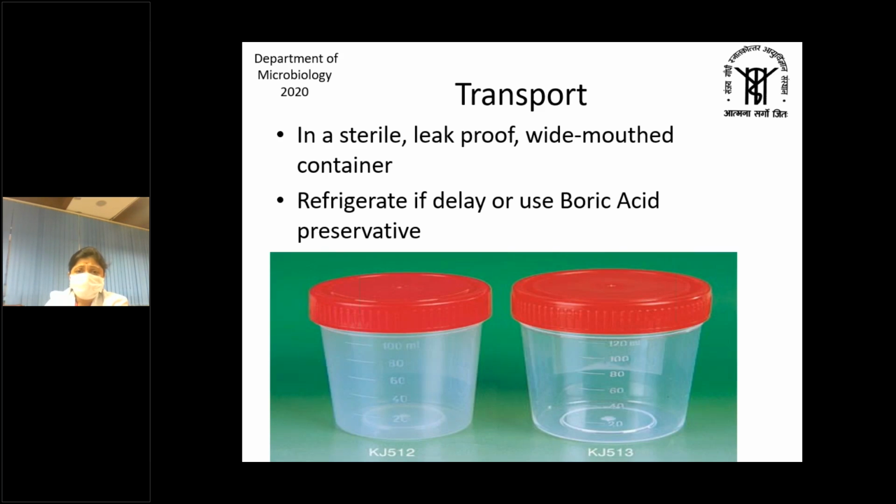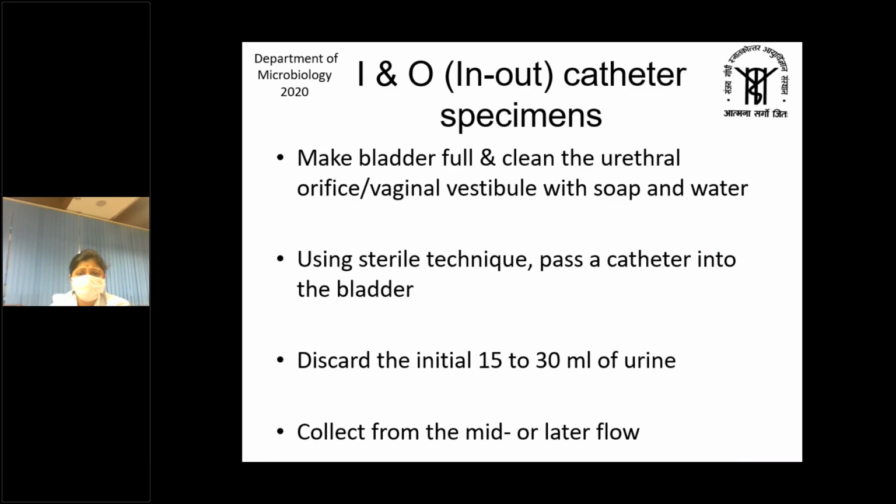Then these are the usual containers that we have: sterile, leak-proof, wide mouth containers. We can use a few preservatives, but generally the urine samples are processed in the lab in the forenoon as well as the afternoon. So within 1 hour or 1.5 hours, the culture is put up.